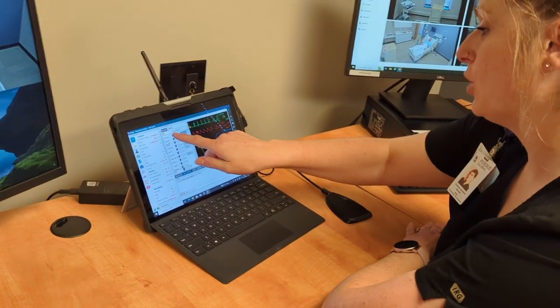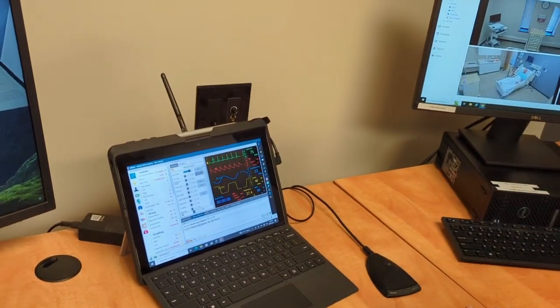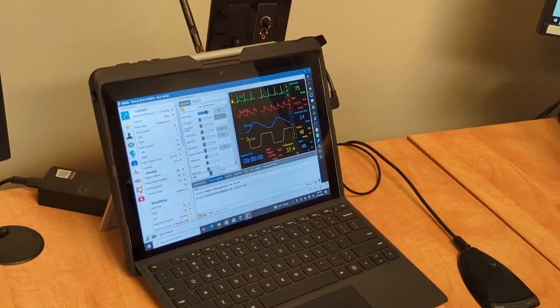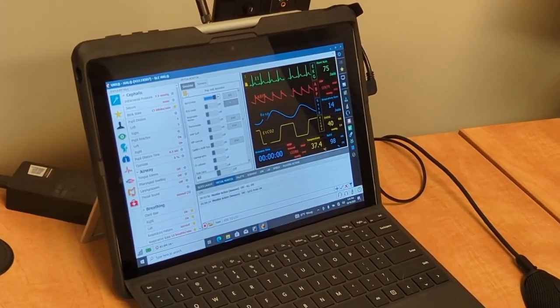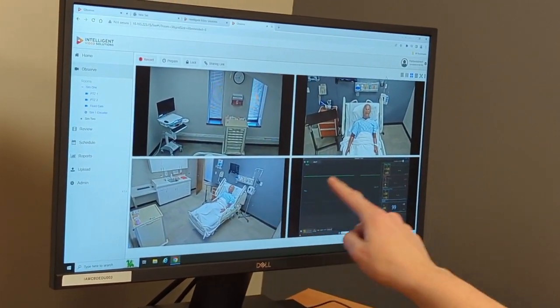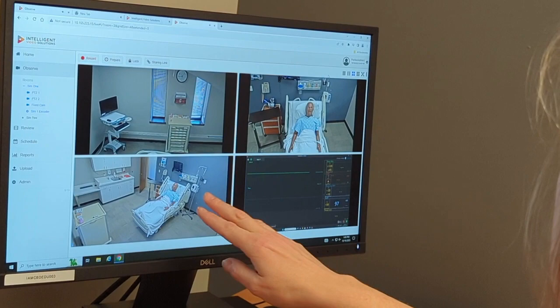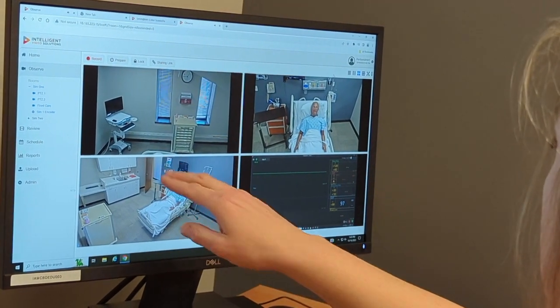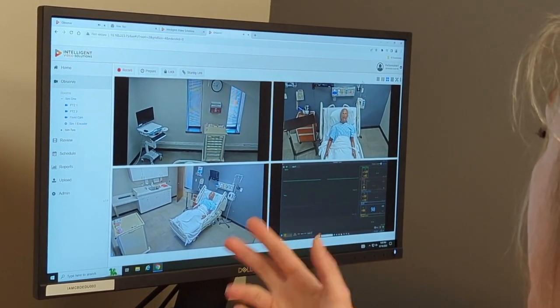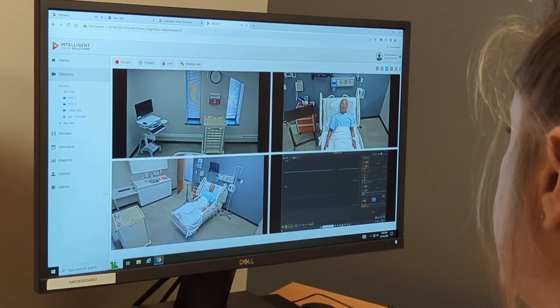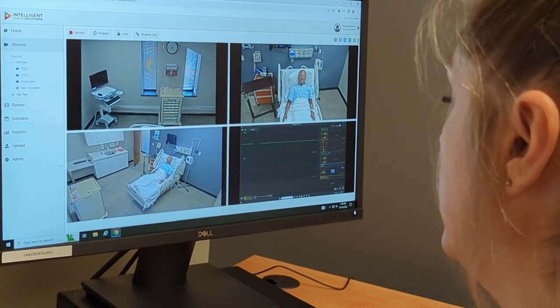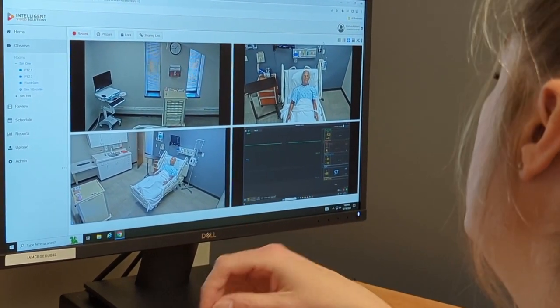I'm going to show you. So SpO2 probe — I'm going to go ahead and put that on there. They'll put an SpO2 probe on this patient here, and when they do that, they'll state to their partner using closed-loop communication: 'I have 98% on four liters of nasal cannula.'